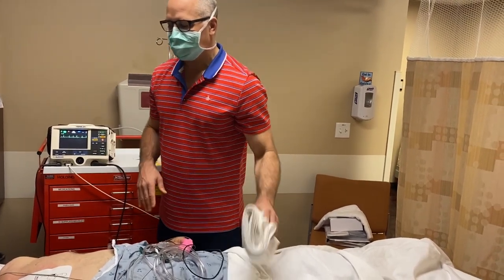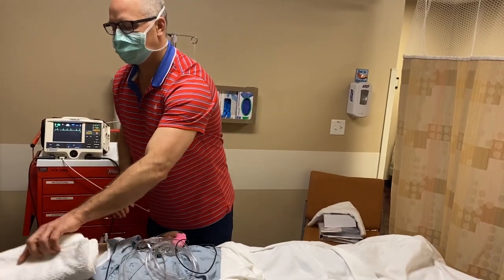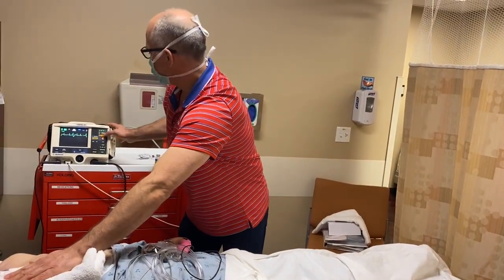Since he is adequately sedated, we can proceed with the cardioversion. It's helpful to apply some manual pressure.